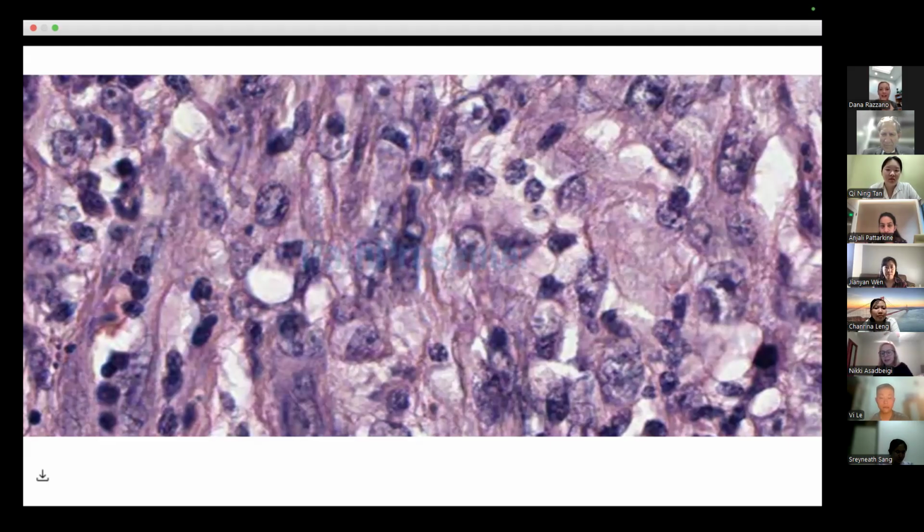Again, if you're having an intradermal nevus, don't order it. It's going to come back positive sometimes, and it's going to be, oh, what should I do with it right now? But if it's diffusely positive, if it's strongly positive, especially in the borderline lesion, it's a very good marker. In almost all of melanomas, if it's not desmoplastic, I see positivity of it. Oh, interesting. Yeah, it's good for melanomas, I think. But the problem is it can be positive in non-melanomas.